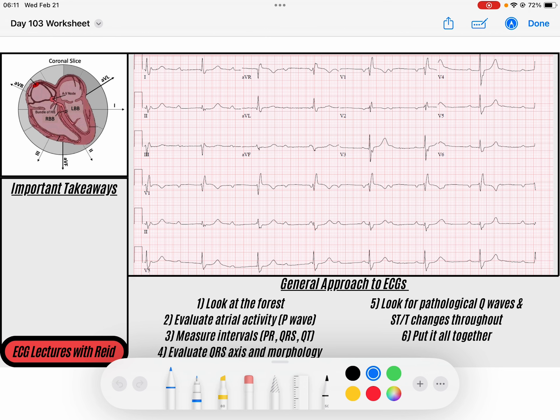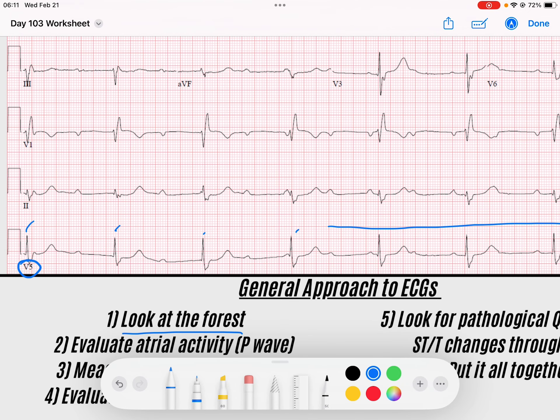This is a really fun ECG - a great example of something we sometimes call. The first thing we do is look at the forest and the trees. The QRS complexes - I'll come down here to V5 - we've got a regular complex rhythm that seems to be a little bit wide, but it's regular and stays regular throughout the entirety of the strip. If I measure the rate, I see a QRS landing on a solid line: 300, 150, 100, 75, 60, 50 - this is about 43 beats per minute.